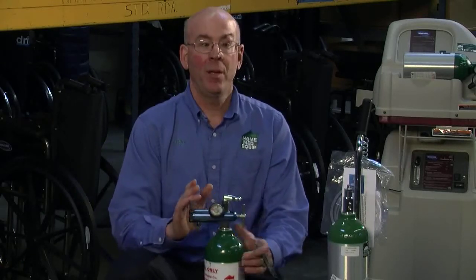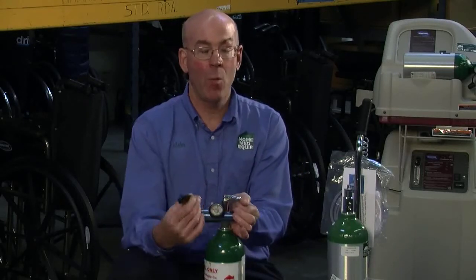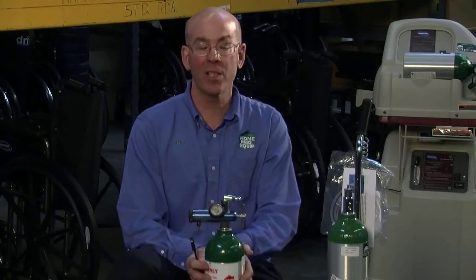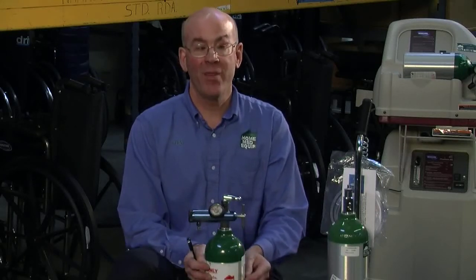To talk about how long the cylinder will last: at one liter a minute, each E cylinder will last approximately 11 hours. At two liters a minute, each cylinder will last approximately five and a half hours. At three liters a minute, each cylinder is good for about three hours and 45 minutes.